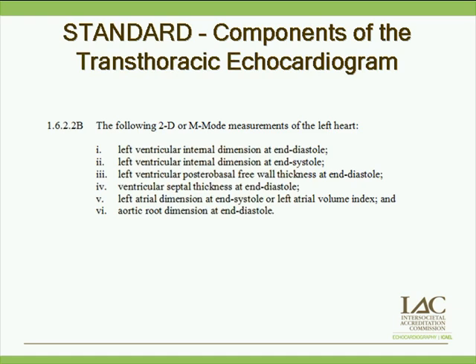The following 2D or M mode measurements, and again, you see it says 2D or M mode. It is up to your laboratory to decide whether they want to do M mode or 2D or both or however you want to do it, but it does say 2D or M mode.